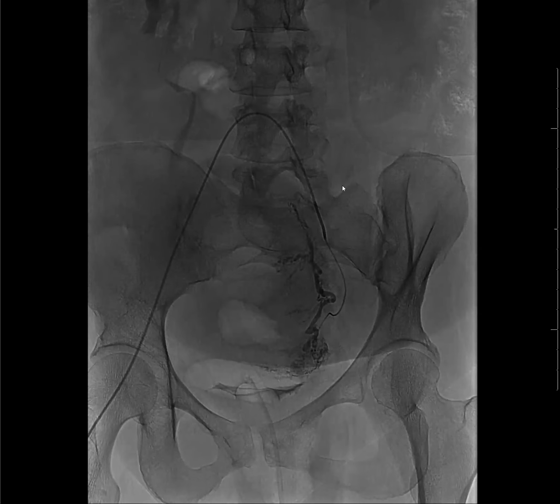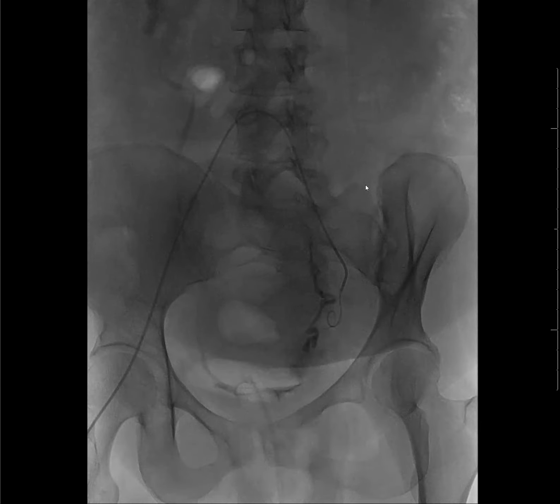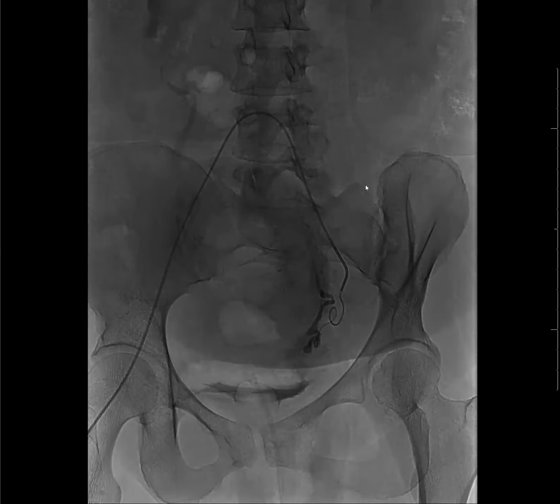Wow, it's very interesting, because you would think with a C-section they'd be able to see everything, but I can see how a small piece of the placenta could be missed, because the placenta is really big. Even though it looks big in this, your retained thing here is actually small compared to how big the placenta is. So I could see how they could miss a little part of it as they're pulling it out, I guess.